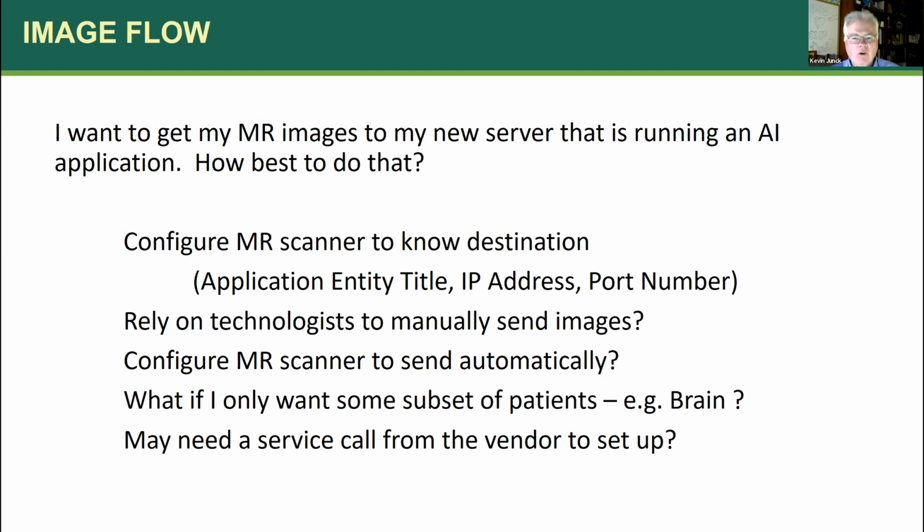So, okay, now I've got this new server, and we've worked with the vendor. It's running the software. I've got to get images from the scanner to the server. Well, some MR scanners, you can just sit down and configure the MR scanner yourself. Sometimes you need to make a service call to the vendor to get in and access and set these things up. Different modality vendors behave differently.